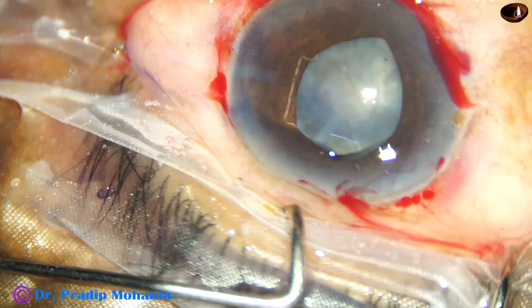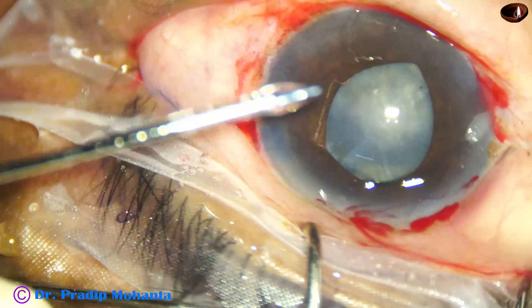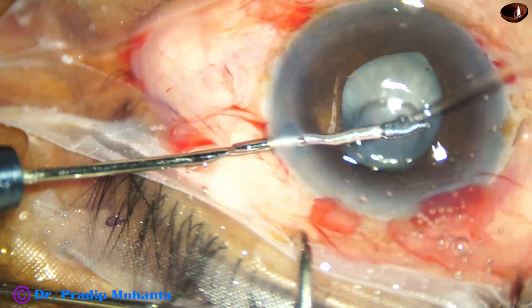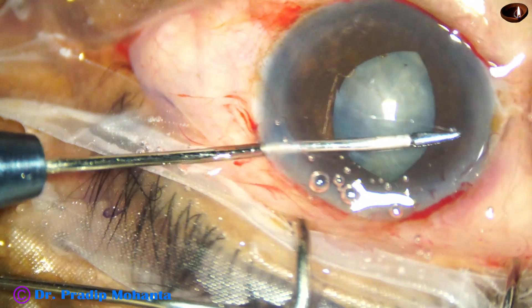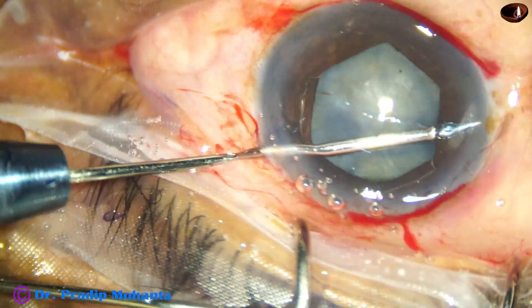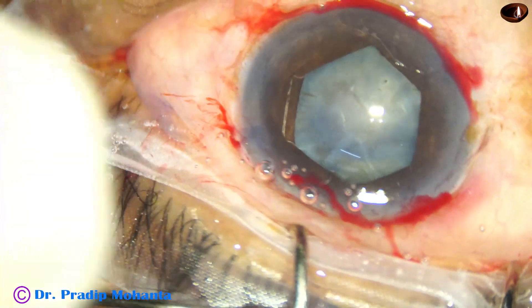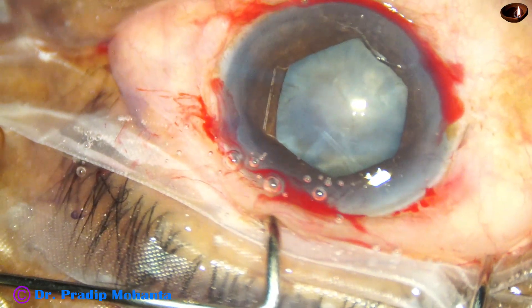The notches straddle the iris. Through the left side port, the flange which is on the right side of the main wound is placed under the iris. Visco again, and now capsulorhexis.